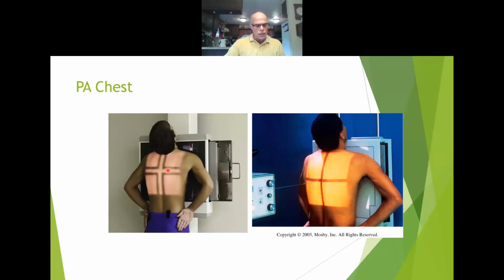For certain conditions, such as a pneumothorax or the presence of foreign body, radiographs are sometimes made at the end of full inspiration and expiration, and we said that earlier. And the one thing I want you to do, I want you to go back on page 88, and I want you to read on the right main bronchi, the way that it is situated and the way that it bifurcates off of the trachea. It says that it bifurcates higher, it's wider and shorter.